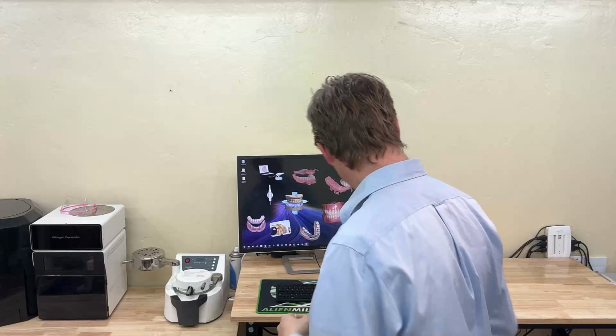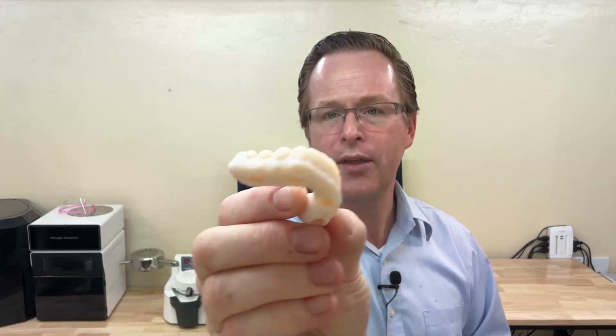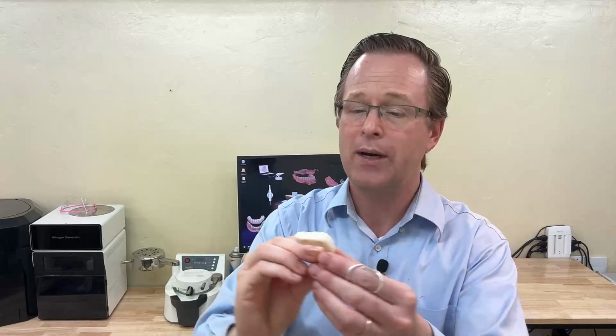What do I mean by that? So if we were to use just the standard anatomic Pontics wax up mode, you'd end up with a prosthesis that would look like this. It'd be a monolithic, one piece, either zirconia, printed, or milled restoration that we'd have to cut back, put some pink gingiva on, etc. Very cool, very strong, very tough.